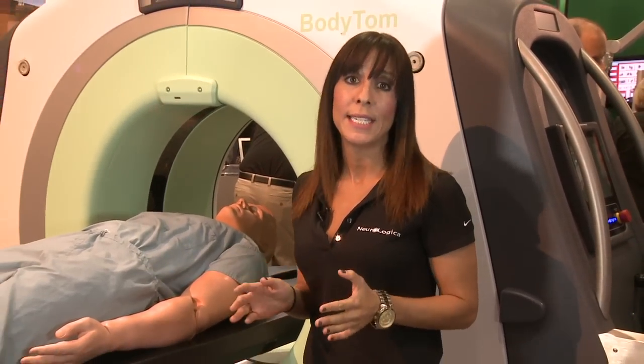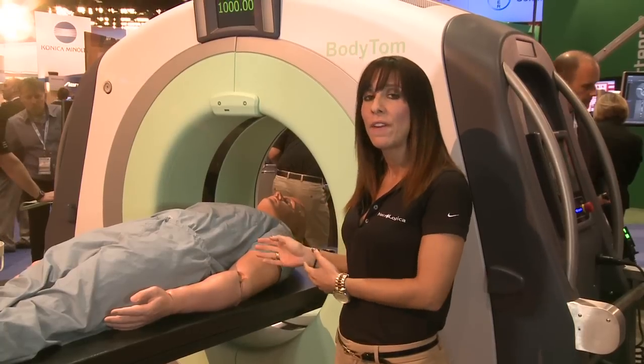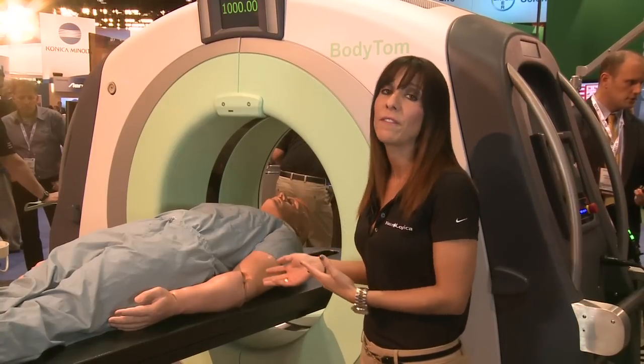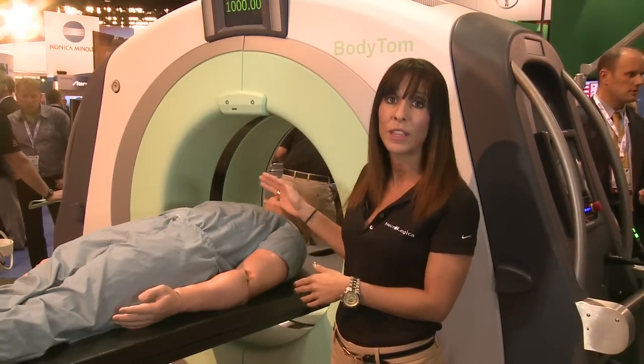The BodyTom is the world's only portable true CT scanner and it has a number of unique features. The first is that it has an 85 centimeter gantry with a 60 centimeter field of view. Another unique feature is that the BodyTom is actually internally lead shielded, so the covers are lined with lead.